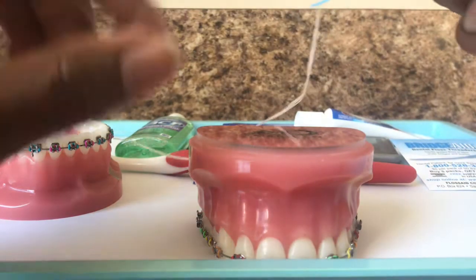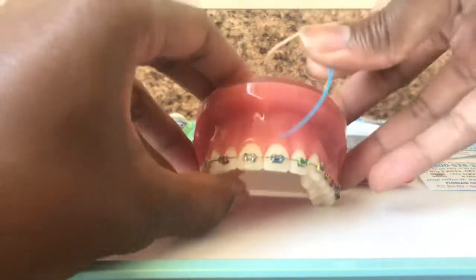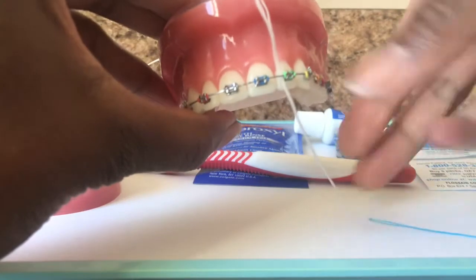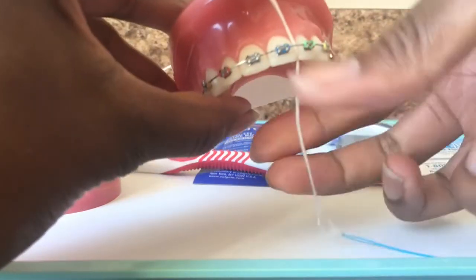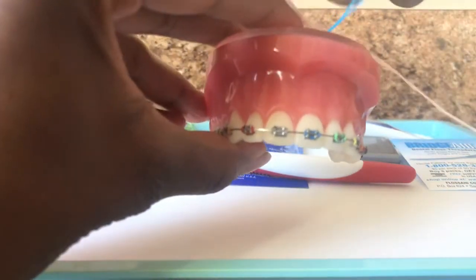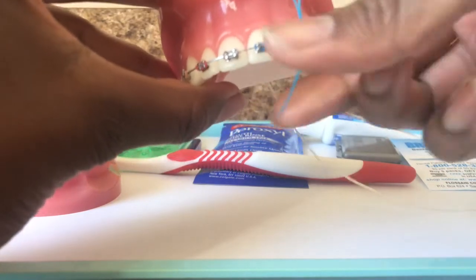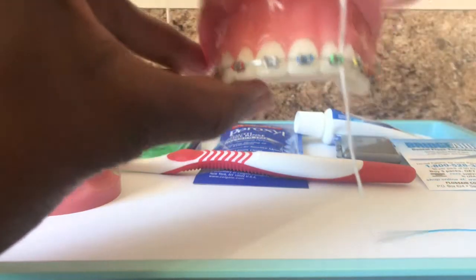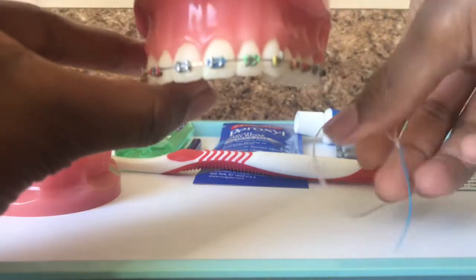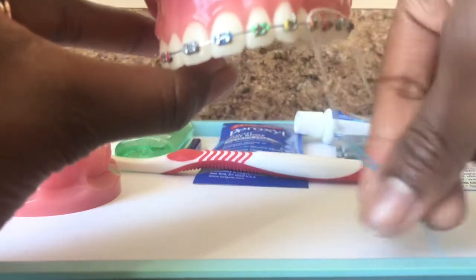Once you get that done, you do have to go back and do each section the same way — taking the end of the tail through the next section, pulling it through, then flossing up and down as normal. This does take a while, so we do reiterate to our patients that you have to spend more time brushing and flossing. When you typically spend maybe two minutes brushing, you want to spend maybe five minutes brushing, and make sure that you're brushing and flossing daily.